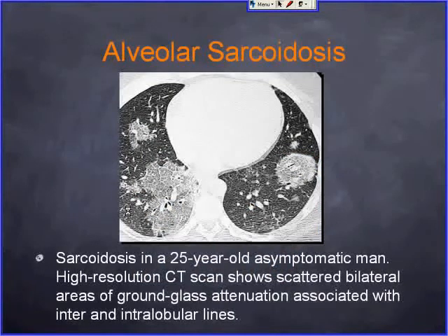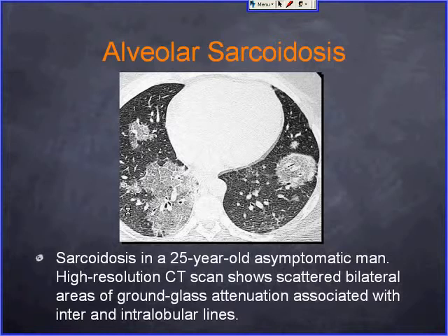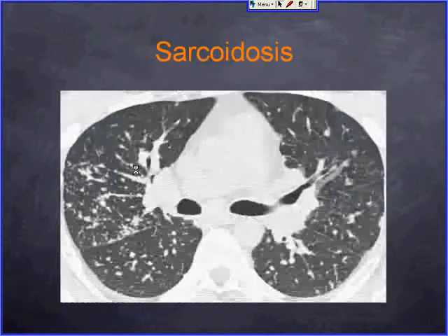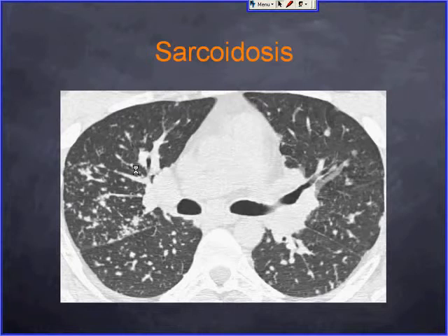Alveolar sarcoidosis is a subtype of sarcoidosis in terms of radiographic appearance. In a 25-year-old asymptomatic patient, high-resolution CT shows bilateral ground glass opacity with interlobular and intralobular lines. This is certainly not the typical presentation; the most typical sarcoidosis appearance is peribronchiovascular nodules, which when seen allows you to confidently call sarcoidosis.